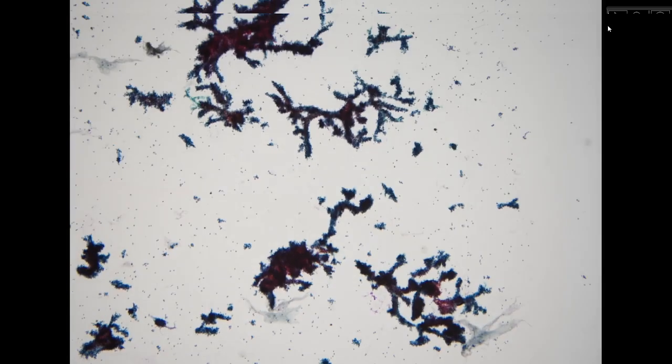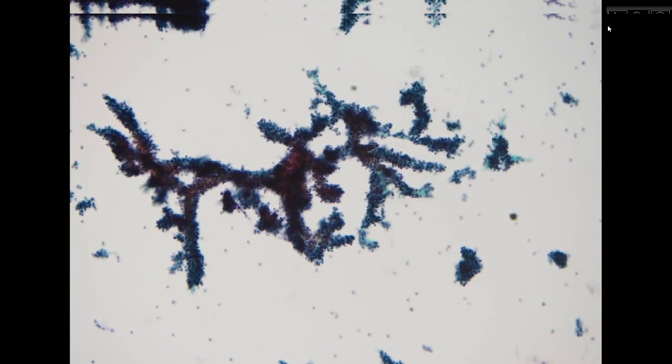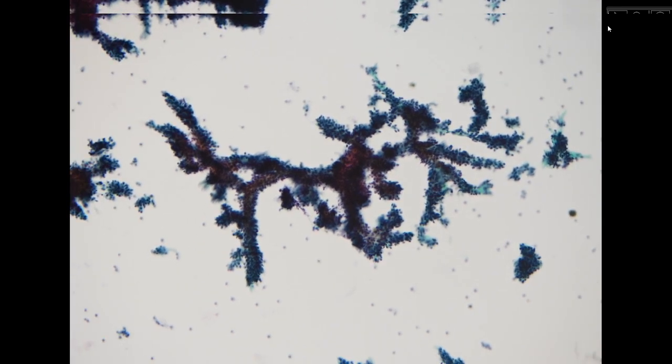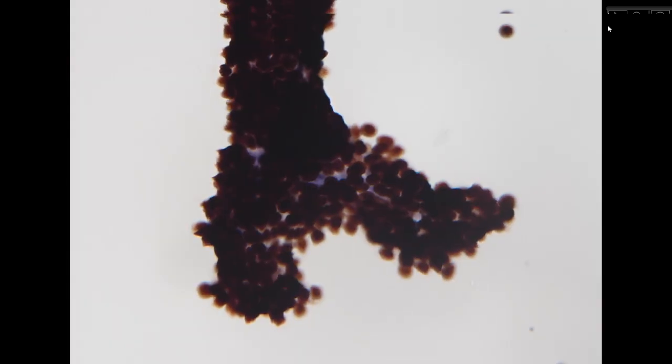So the next specimen, we saw this yesterday or the day before yesterday. Originally it was said to be coming from the thyroid, but based on the cytomorphology, we know that this is most likely a parathyroid lesion. So we do a cytospin preparation for immunocytochemistry. This is the GATA3. GATA3 is a transcription factor, so it will express as a nuclear staining. This is diffusely positive for GATA3 in the nucleus, so consistent with a parathyroid origin.